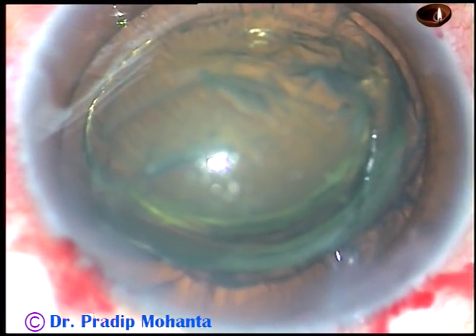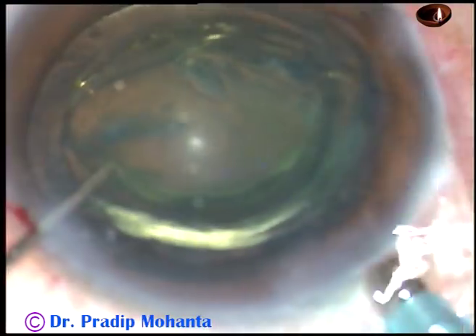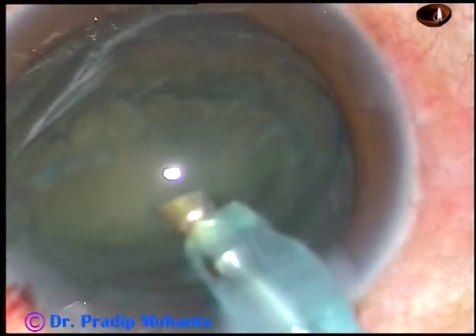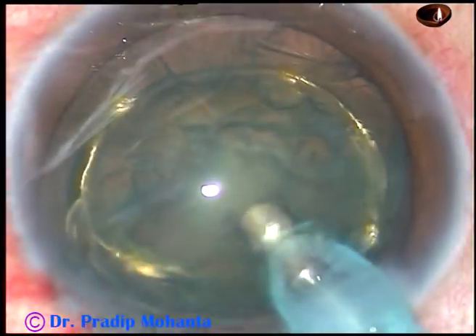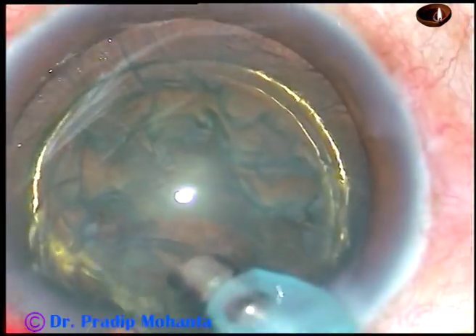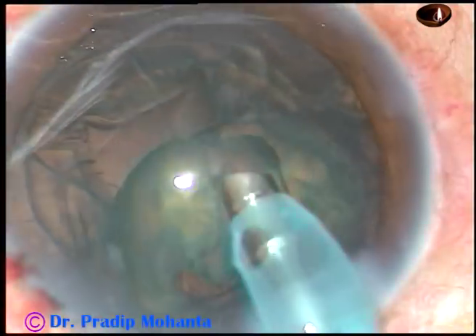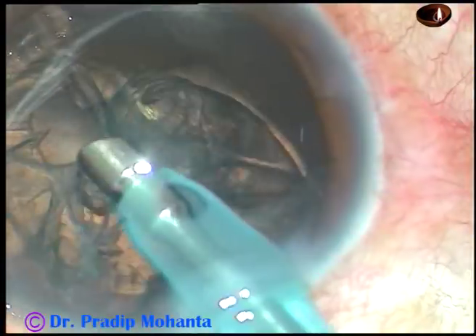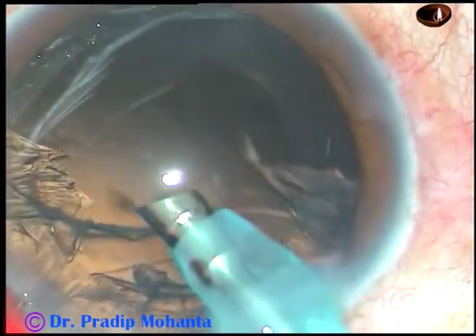I didn't try to push this equator back into the capsular bag — I just want to manage it like this. Since the nucleus is soft, I decided to manage it single-handedly. Just watch the bevel: sometimes it is sideways, sometimes it is towards the posterior capsule, and sometimes up — and in no time the lens mass is gobbled.